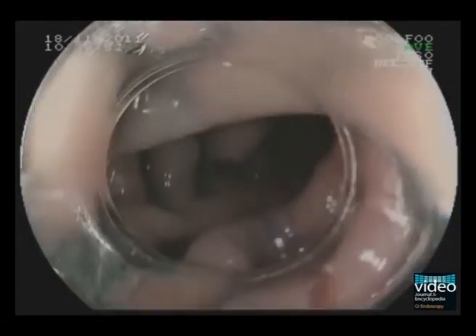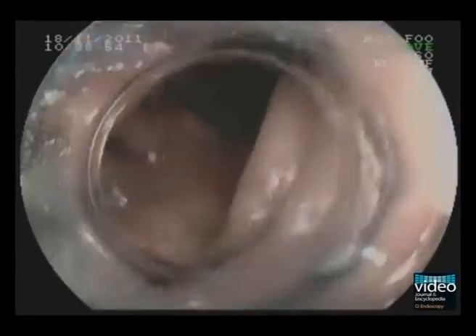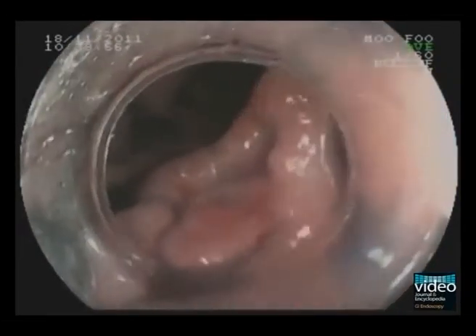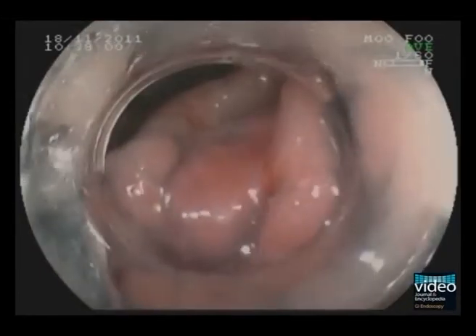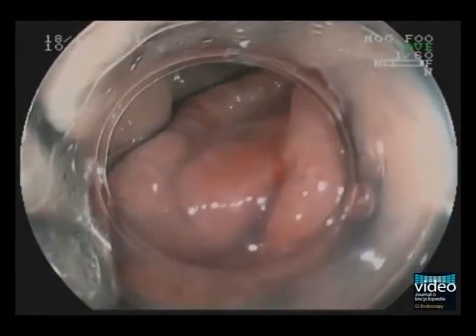According to the Japanese classification, it can also be classified as a non-granular, laterally spreading tumor. Here we see that the depression is almost circular, highly suspicious for submucosal invasion.